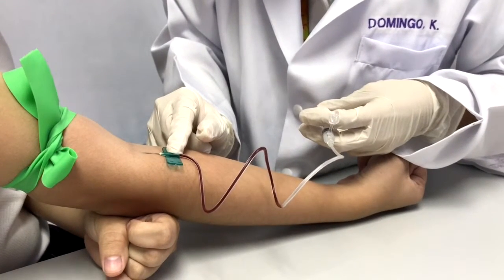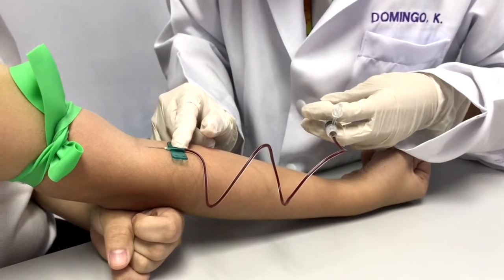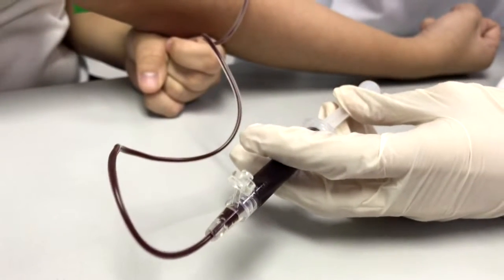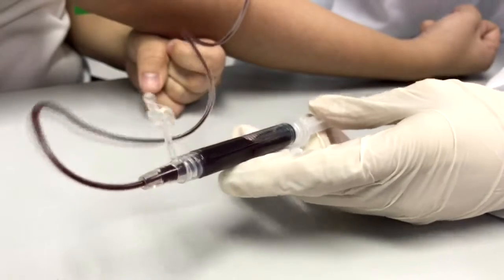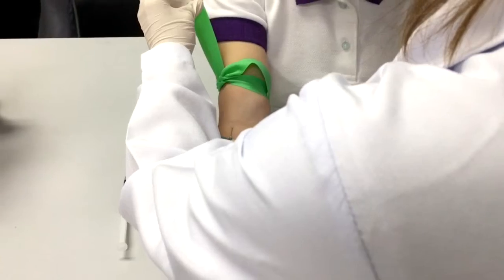Establish blood flow by aspirating the syringe once you see blood enter the hub. Once the syringe is filled, release the tourniquet.